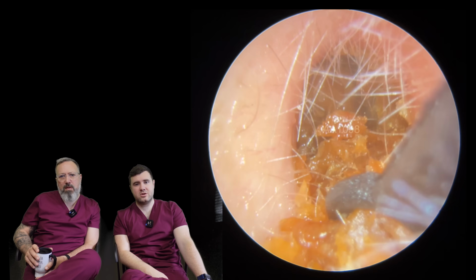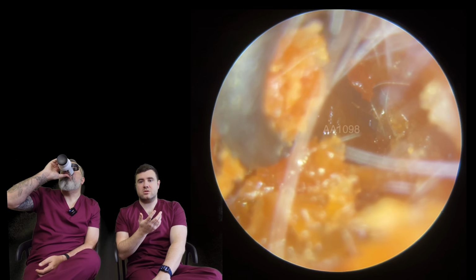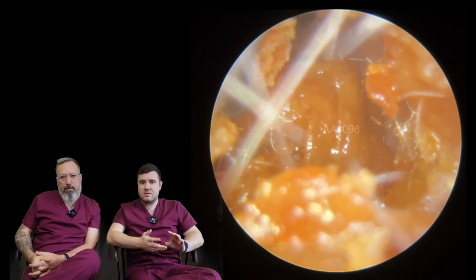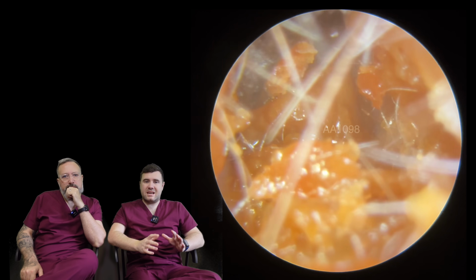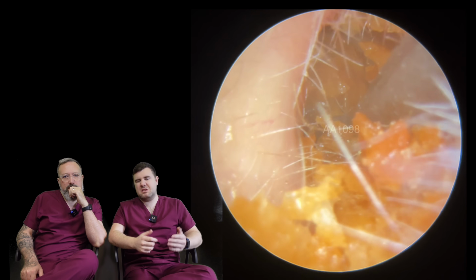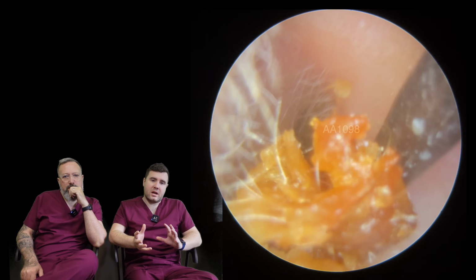It's always very tricky, because with tinnitus, to a certain degree you can use suction like fine ends, which generally we tend to find doesn't affect many patients' tinnitus. The tinnitus can be caused by the wax. So usually, taking a blockage of wax out can sometimes either completely get rid of the tinnitus if you've got a little bit of buzzing, or it might make it quieter.